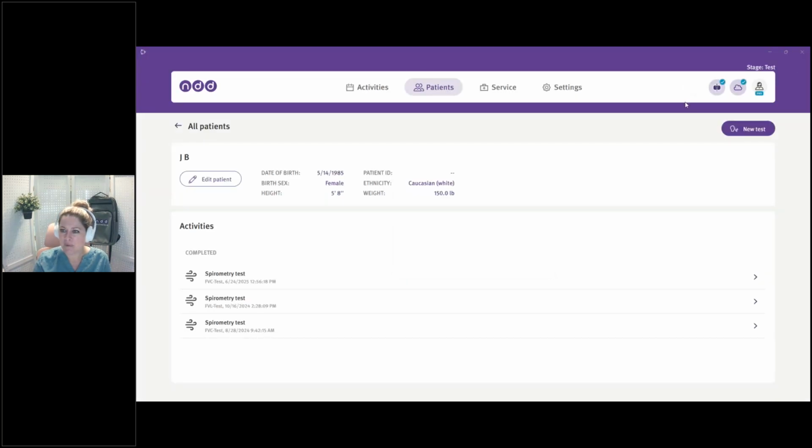All right. I am going to pause sharing my screen here for just a moment so that we can get the device ready to test.